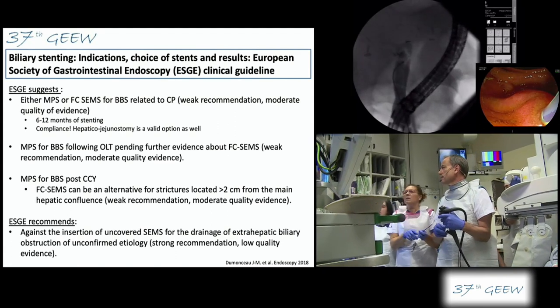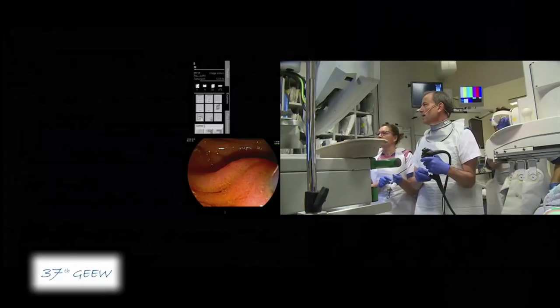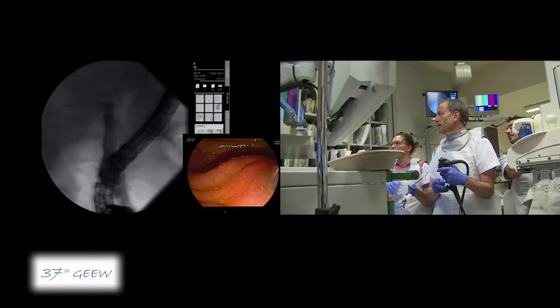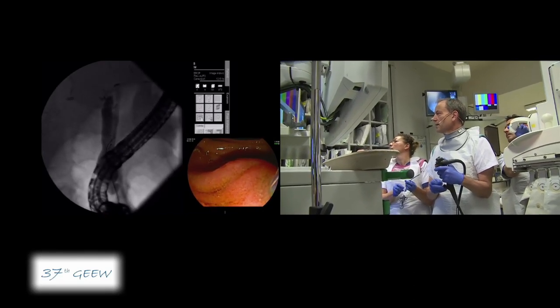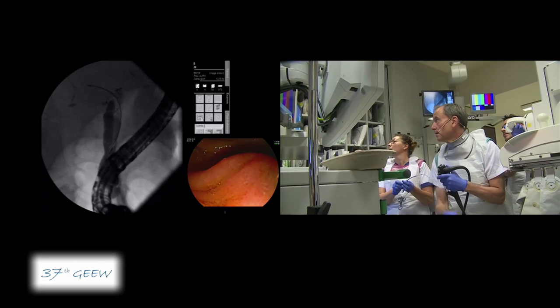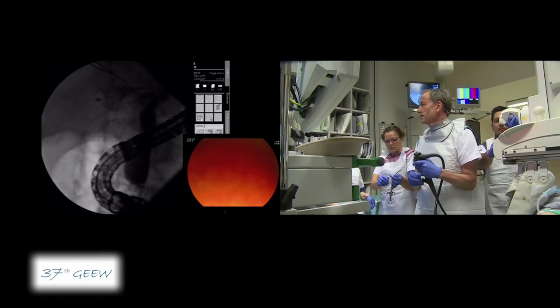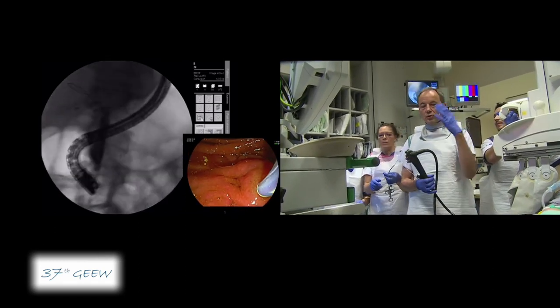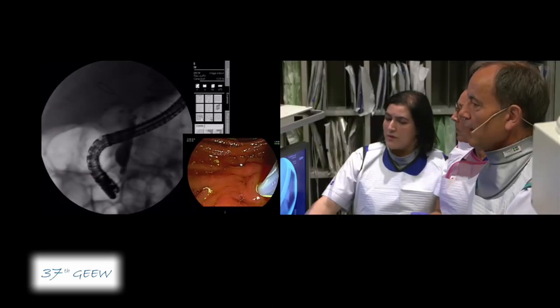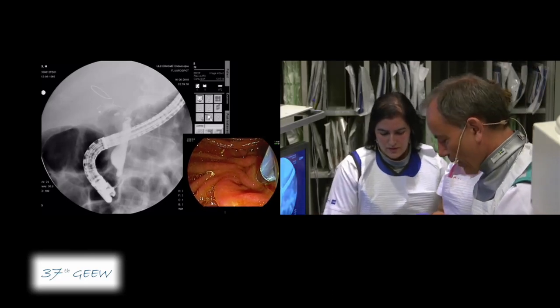This can be the remnant of the cystic duct. It looks like we may have been in the cystic duct — now we see it. You can see the anatomy much better now. It's important to rotate either the X-ray to get another plane, or the patient, which we did. We keep the wire in this position.